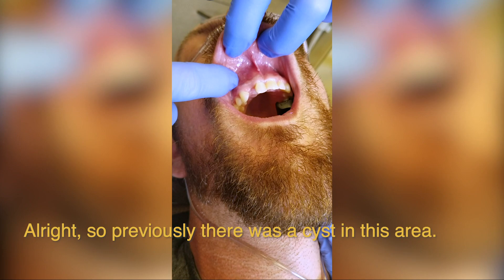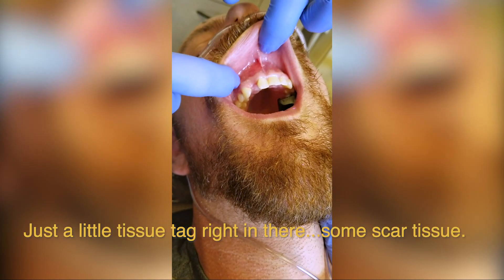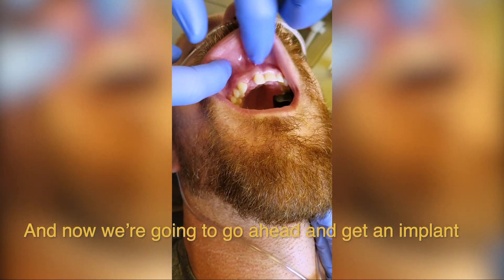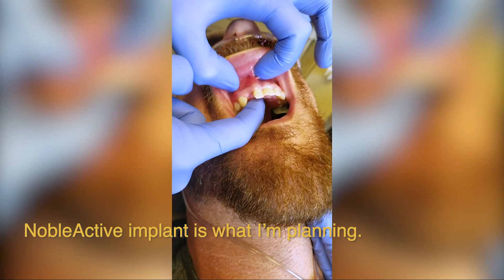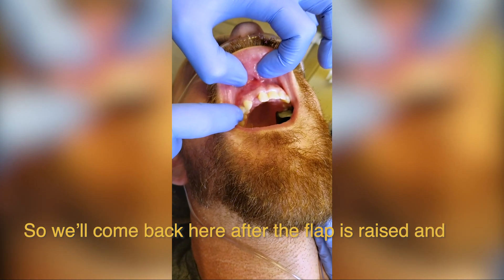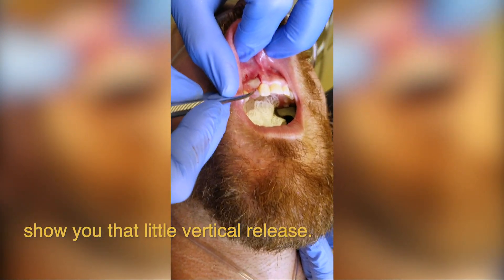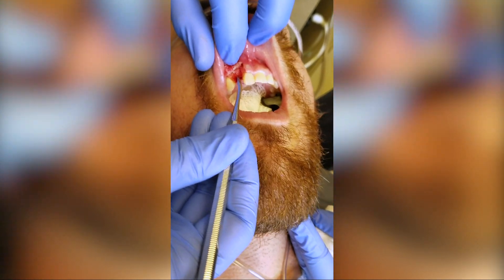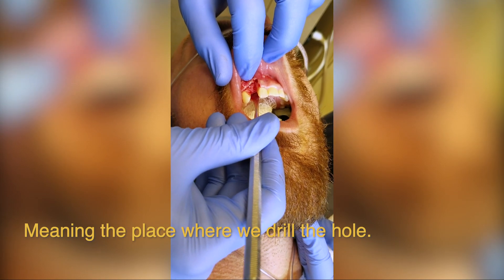Previously there was a cyst in this area — you can see that things have healed quite nicely. Just a little tissue tag right in there and some scar tissue. Our surgical site looks great with tons of bone, and we're going to go ahead and get an implant in that spot. This looks like 3.5 by 13 — a Noble Active implant is what I'm planning. We've raised the flap here, with a little vertical release. Lots of bone. We're going to place an implant right in this area and I'll show you the osteotomy site — the place where we drilled the hole.